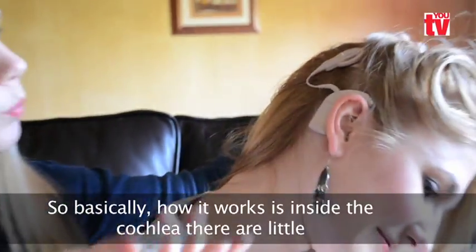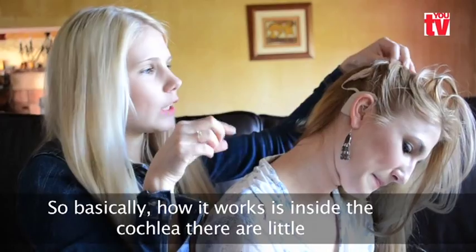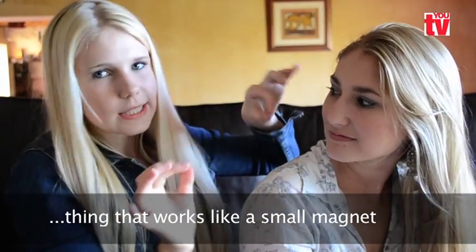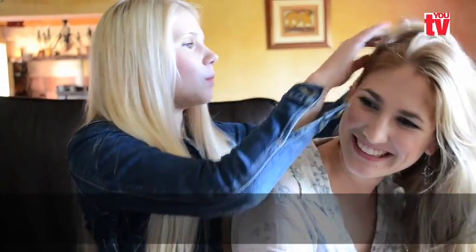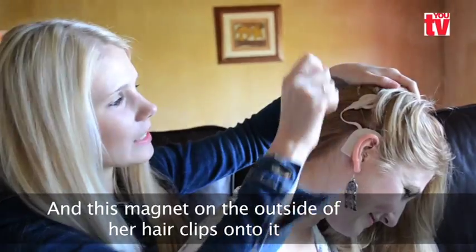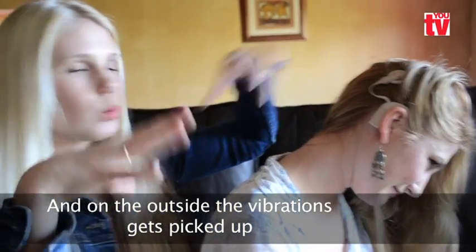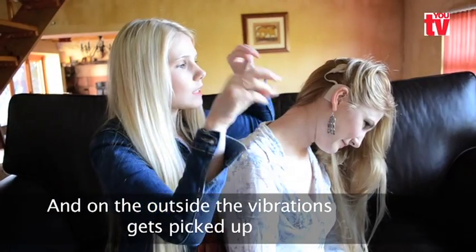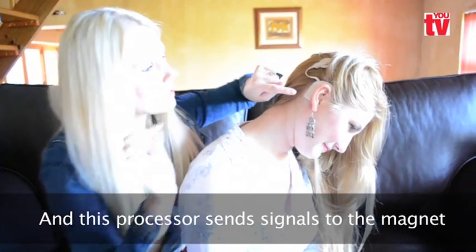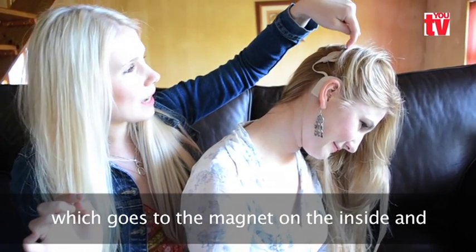So basically how it works is that inside the cochlear, you get this little thing that looks like a small magnet with a tail on it. And this magnet on the outside is clipped onto that internal magnet. The vibrations in the environment are picked up by this processor, and this processor sends the signals to the external magnet, which goes to the magnet on the inside.